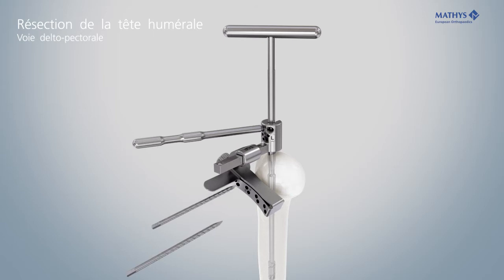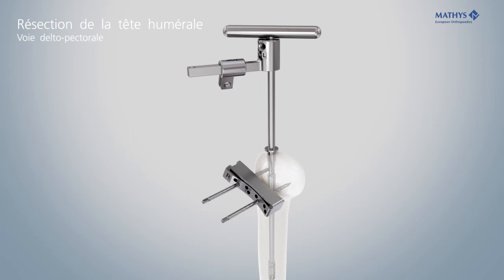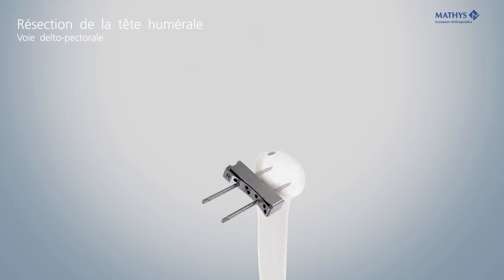Insert two 3.2 mm pins through the pre-drilled holes. Remove all instruments except the sawing block. If necessary, use the stylus again to check the resection height and retroversion once more.